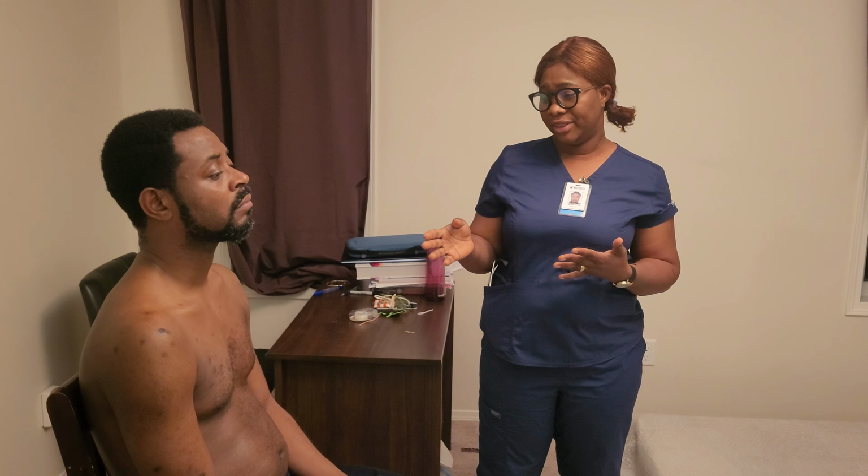So I'll be moving over to auscultation of my patient's anterior chest. Can you please turn this way? While I'm auscultating, anytime I place the diaphragm of my stethoscope on you, you're going to take a deep breath for me. Thank you.